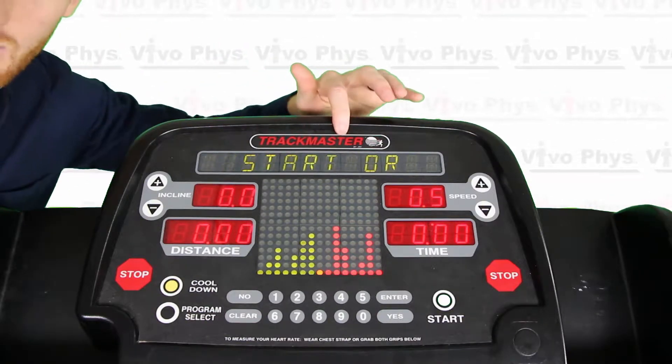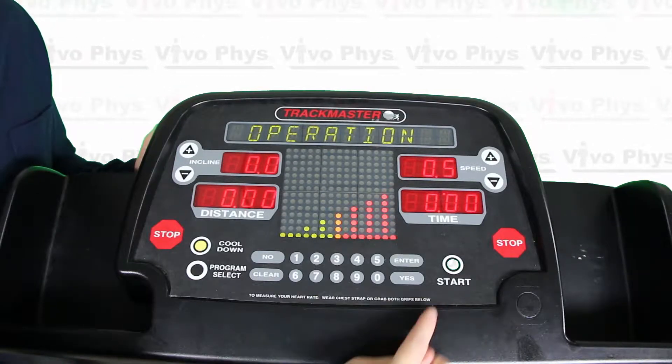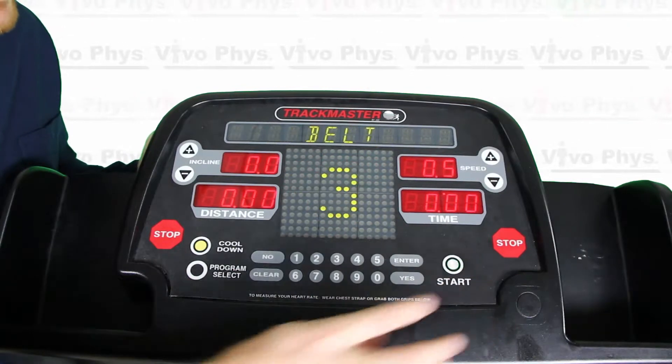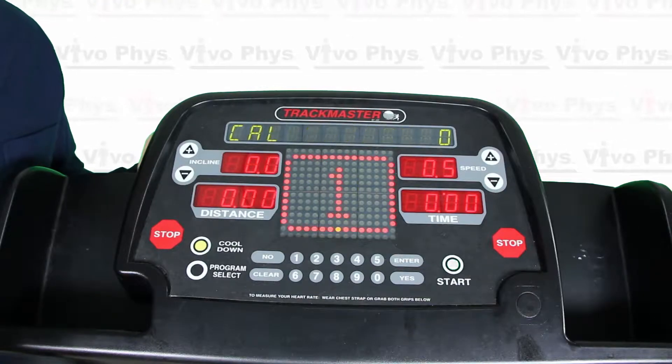So we have pressed start in order to start the treadmill. All we have to do to make the treadmill run is hit this start button here — this is the quick start option. I'm going to hit it now. You're going to see it count down from three, and once it gets to zero the treadmill is actually going to start to run.